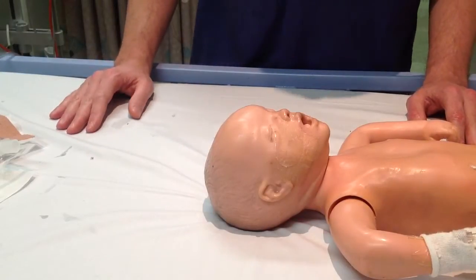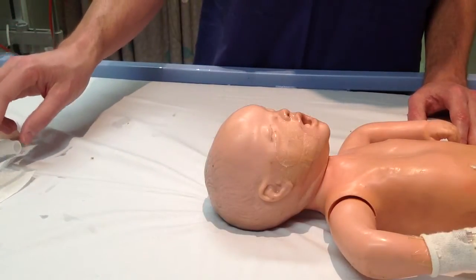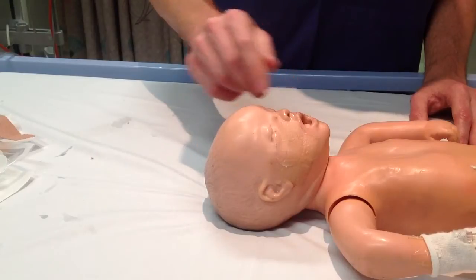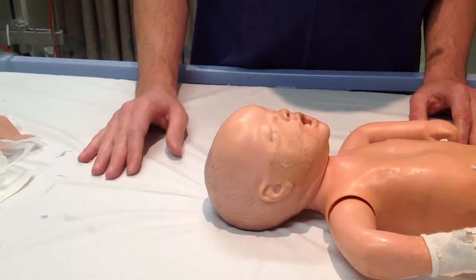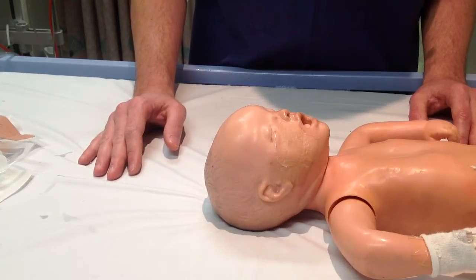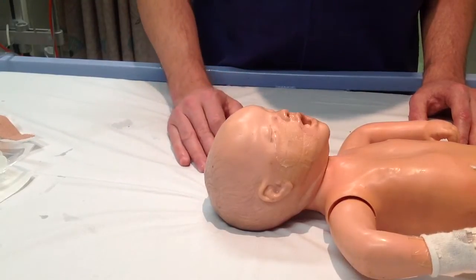What we're going to talk about here is nasopharyngeal CPAP in the paediatric patient with respiratory failure. Nasopharyngeal CPAP, distinct from nasal CPAP, is when you use an airway device to deliver positive pressure to the nasopharynx directly. Nasal CPAP delivers it only to the nostril. Nasopharyngeal CPAP is useful in the paediatric patient in respiratory failure that is failing on high flow humidified air or oxygen at 2 litres per kilo per minute, but where you want to avoid intubating and ventilating. If you can reliably deliver positive pressure to the nasopharynx, you might be able to avoid that.